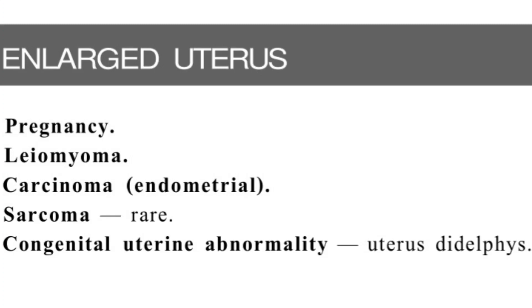There may be endometrial compression, myometrial protrusion, and different types of leiomyomas — subserosal, intramural, submural, and multiple varieties. In case of leiomyoma, the uterus will be enlarged. In case of endometrial carcinoma, the first finding will be endometrial thickening, and this endometrium will be seen embedded within the myometrial part with no clear endometrial-myometrial interface. In that case the uterus will appear either bulky or frankly enlarged.